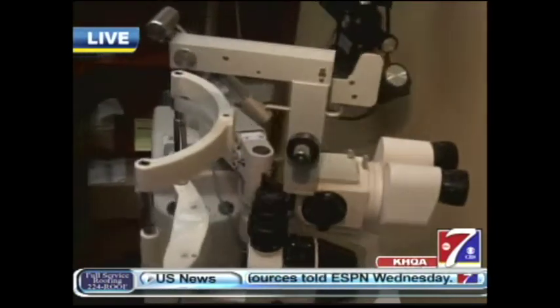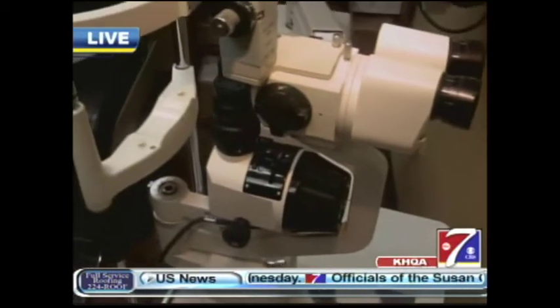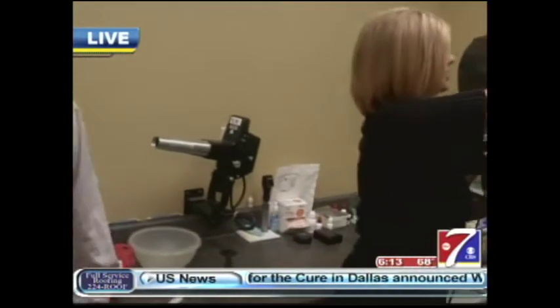And the way that this works is kind of cool. This is the machine that shoots the letters to one mirror, and then it goes back to this thing, which then goes back to that mirror somehow.